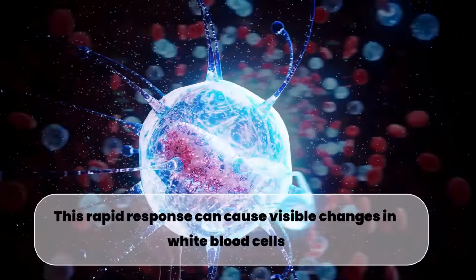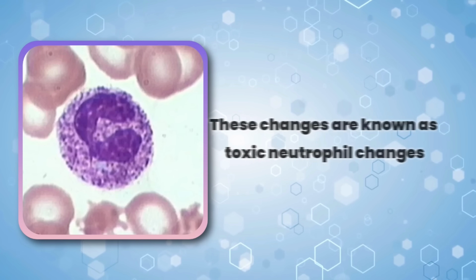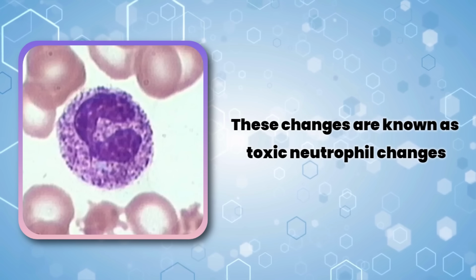In severe infections and intense inflammatory conditions, the body reacts fast to protect itself. This rapid response can cause visible changes in white blood cells, especially neutrophils. These changes are known as toxic neutrophil changes.